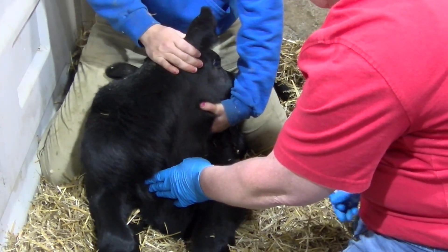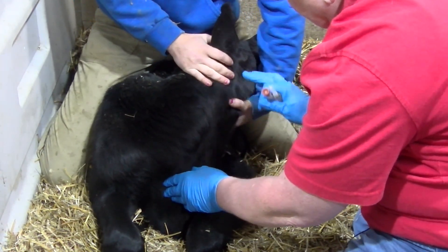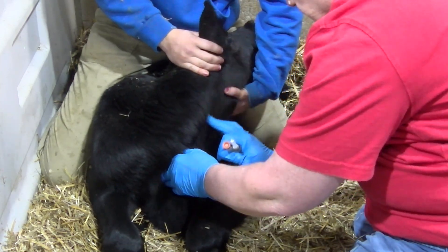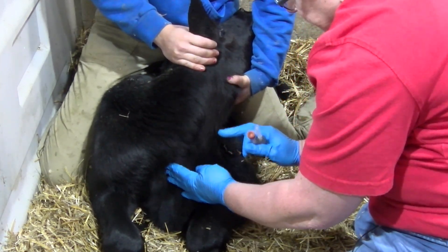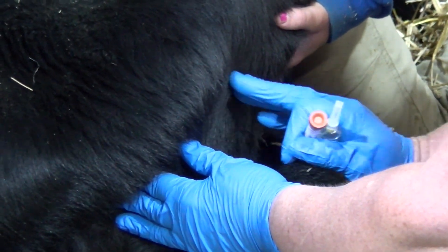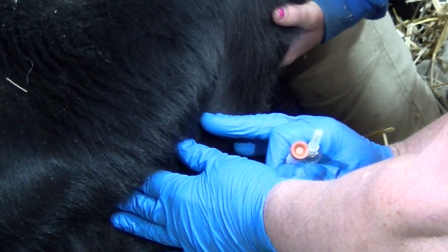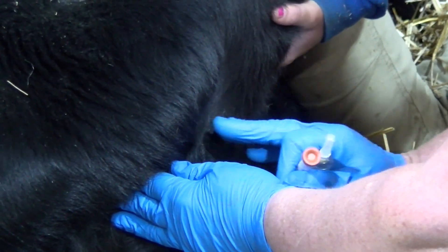When restraining a calf that is lying down, one person will straddle the calf and turn the neck to one side. The person drawing the blood will use one hand to block the vein at the base of the jugular furrow, allowing the blood to build up in the vein. In this video, the vein is blocked by the left hand while the right hand is used to feel for the vein.